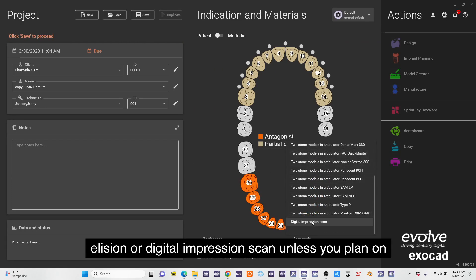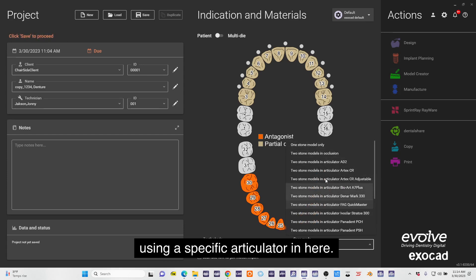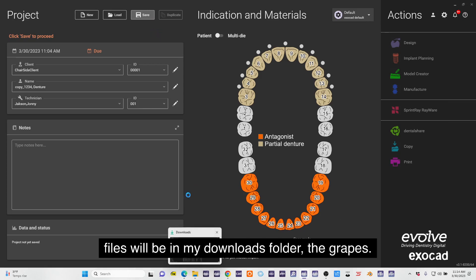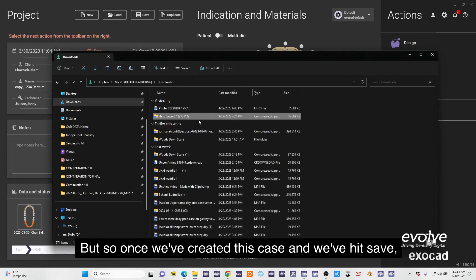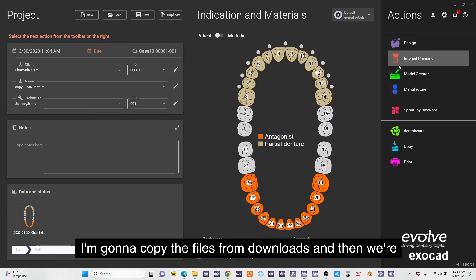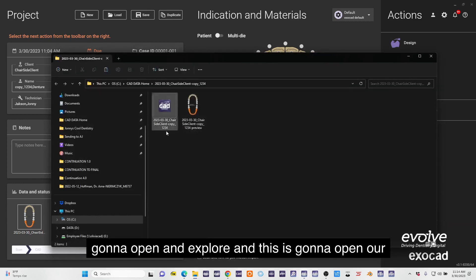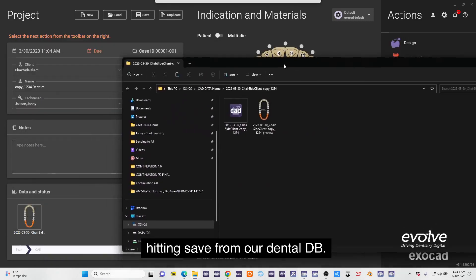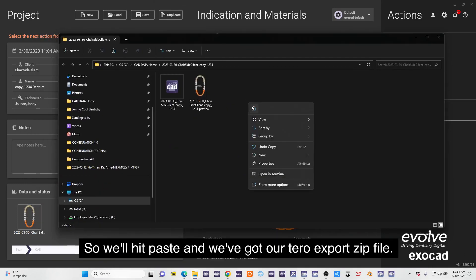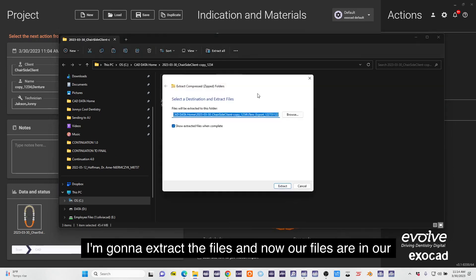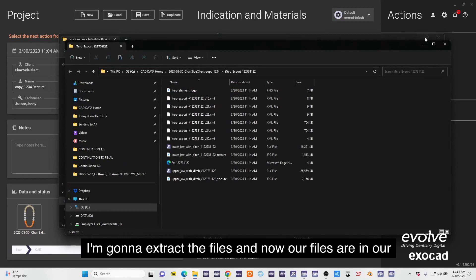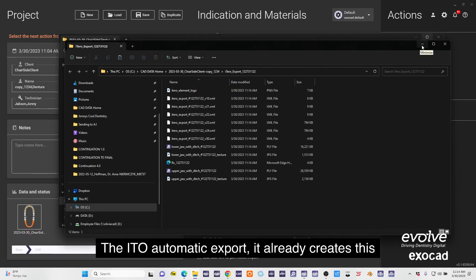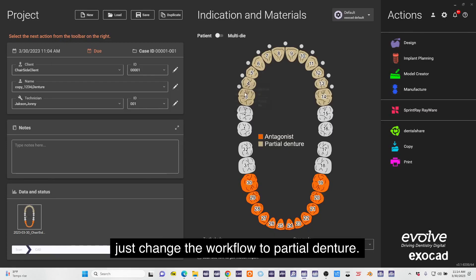I've downloaded the files and those files will be in my downloads folder. Once we've created this case and we've hit save, I'm going to copy the files from downloads and then we're going to open an explorer. This is going to open our folder that we just created. We'll hit paste, we've got our iTero export zip file, I'm going to extract the files. Now our files are in our patient specific folder. The iTero automatic export already creates this database for us and all we need to do is just change the workflow to partial denture.